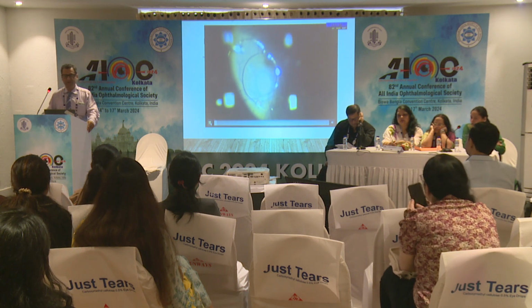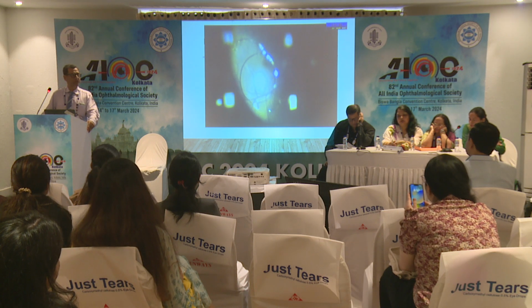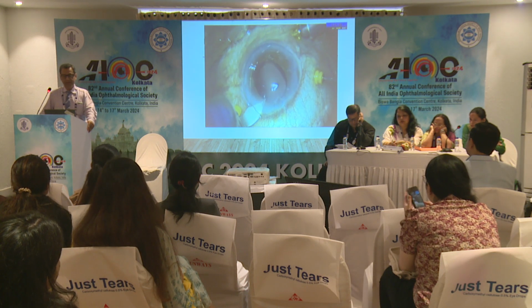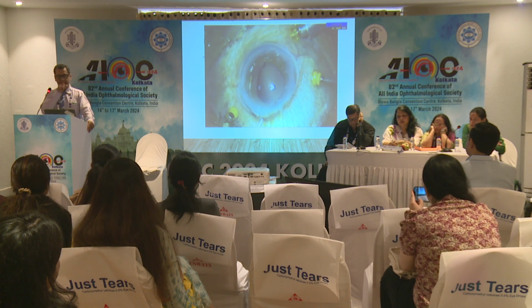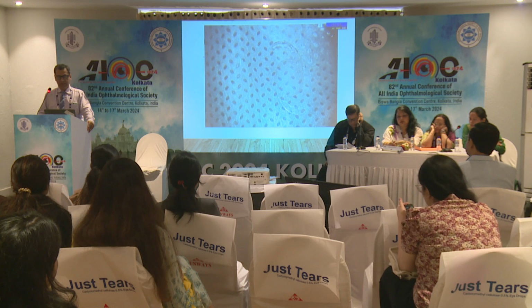So this is one of the first cases I did when I was learning this. This was a 3-piece IOL which had gone into the vitreous after 10 years of surgery, because the Prolene haptics do degenerate over a period of years.